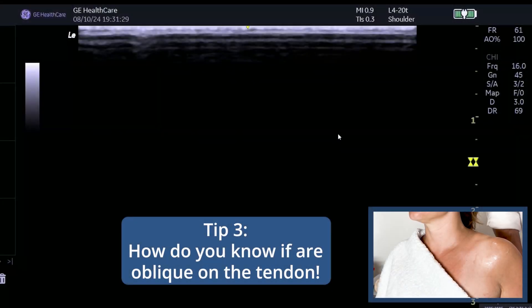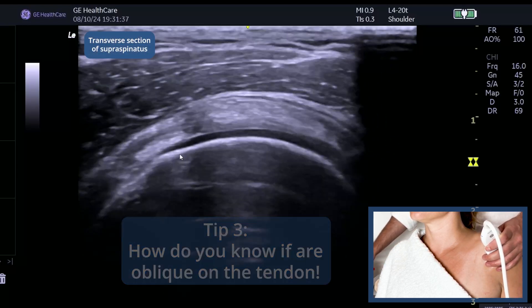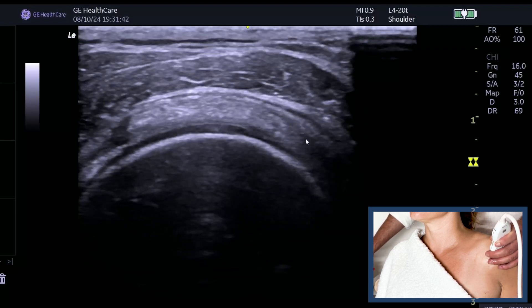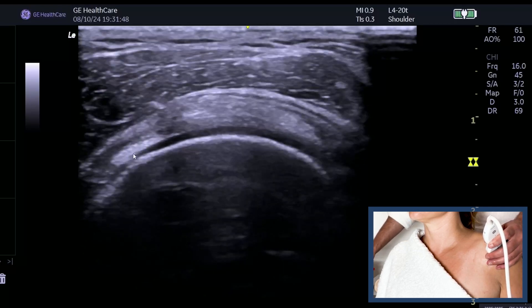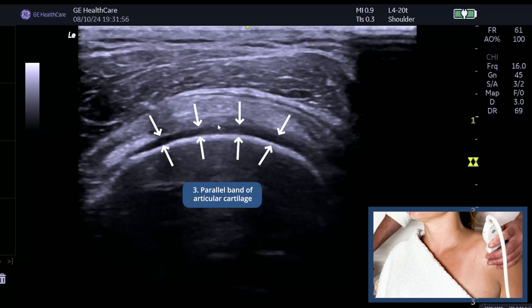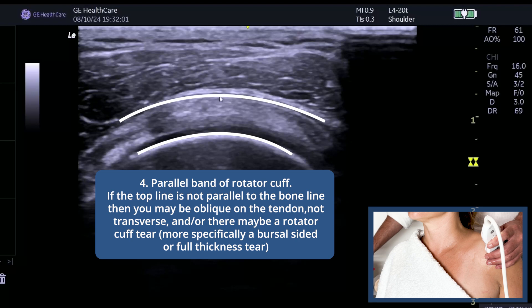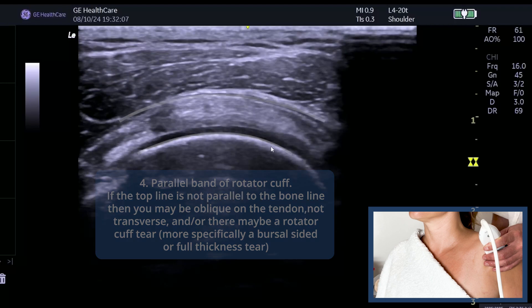Finding rotator cuff tears can be difficult — here are a couple of tips for when you're looking at supraspinatus. This is a transverse image of supraspinatus; we know that because we've got the long head of biceps here, so this is the anterior aspect of supra, and you can see infra coming up here. This is a true transverse image: the bone is bright, there's a nice parallel band of articular cartilage, and a nice parallel rotator cuff relative to the humeral head.